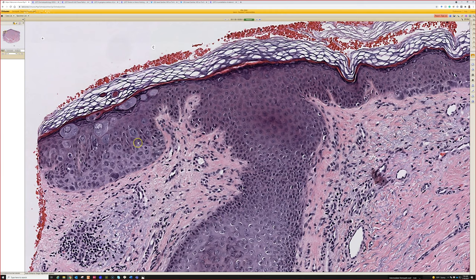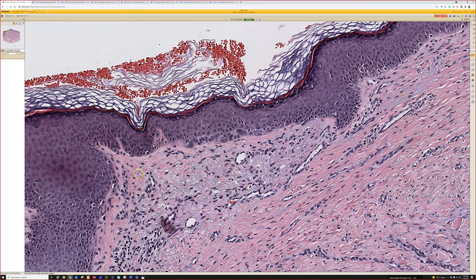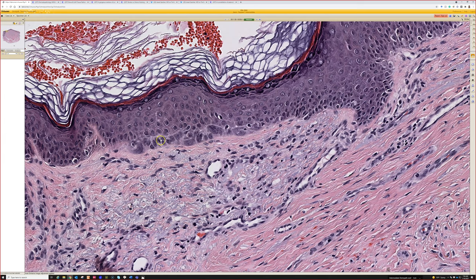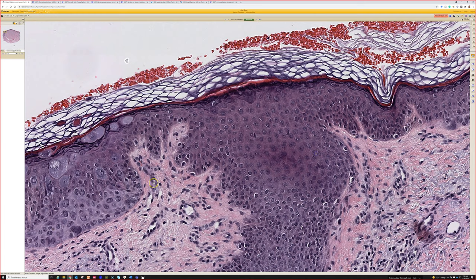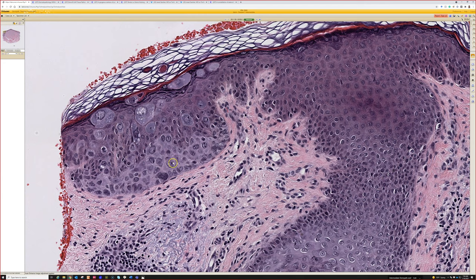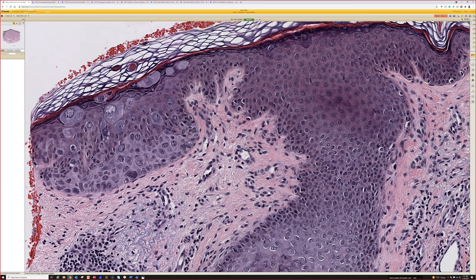In real life you could actually do stains if you had any concern. If I just had this area, I would think of melanoma in situ, squame in situ, or a really ugly AK. I might work this up more and get deeper levels. I might add a comment that this looks like an incidental focus of epidermodysplasia verruciformis, but there's more atypia than usual. Sometimes Bowen's disease or squame in situ can have EDV viral change.